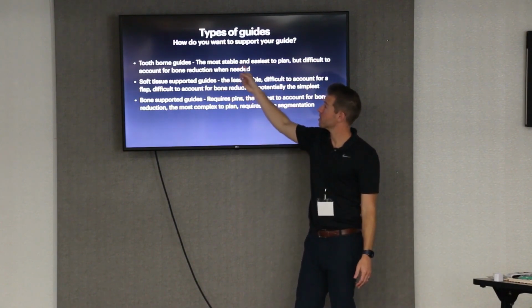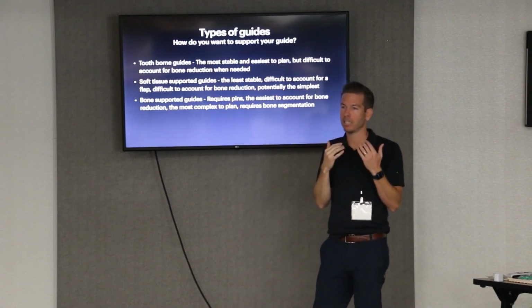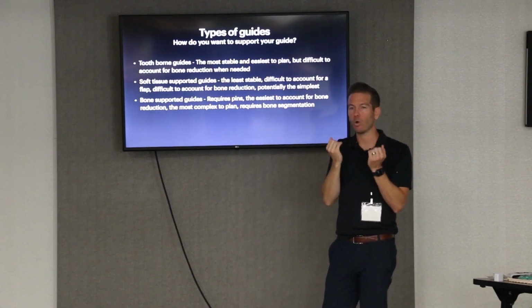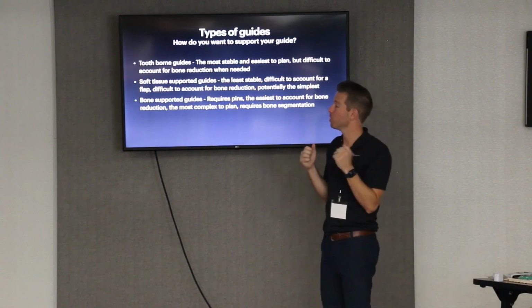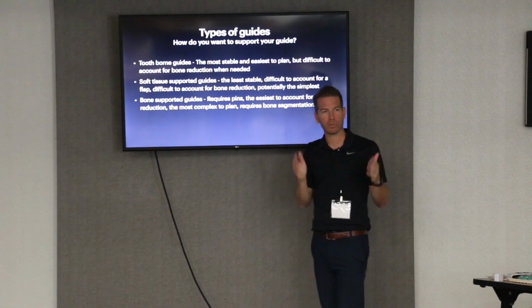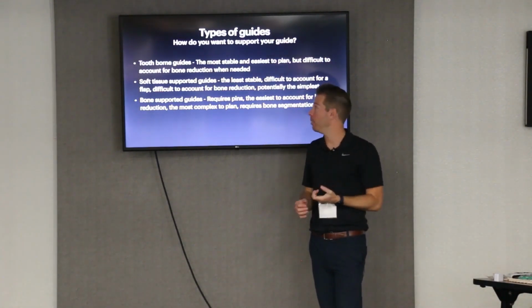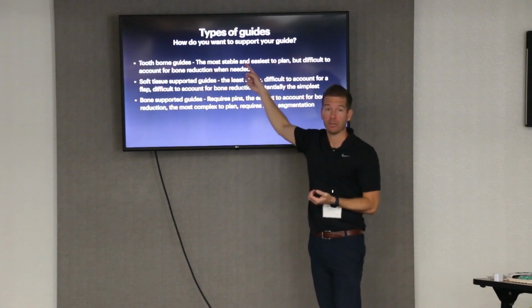They're the most stable. So soft tissue's unstable. It's bouncy. It's not going to hold your guide perfectly in place. Whereas if it's snapped onto teeth, it's the most accurate thing we have. Our intraoral scanners are super accurate. It's going to make guides that are really tight, really snap in. And so if we can do that, we want to try to do that.